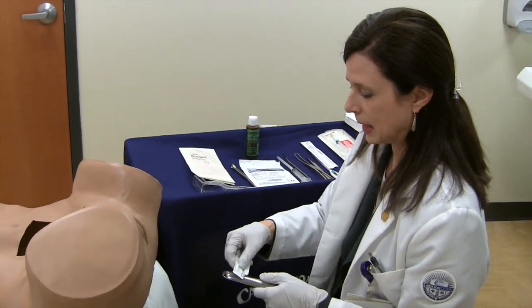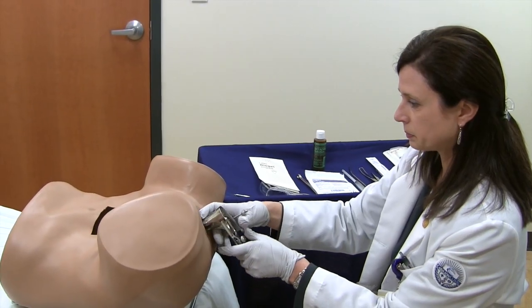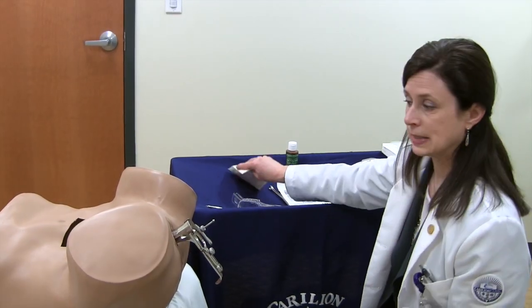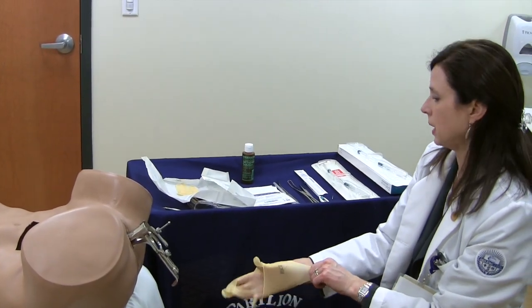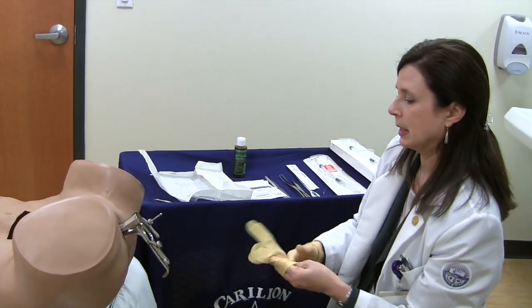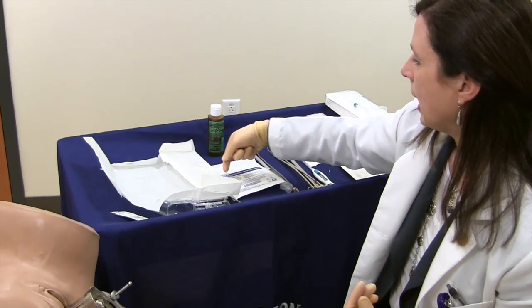We have both metal as well as plastic speculums available. Using a little water-based KY jelly to decrease the trauma on the actual ZOE tissue. Feedback can be given with regard to speculum insertion techniques. Once the cervix is fully visualized, next give a little bit of feedback to the learner about sterile exam and use of sterile gloves. Everything is set up on the table in the order in which the provider will be going through the steps, and it's helpful to have various glove sizes available. The next step is to utilize either a betadine solution, a Hibiclens, and the 4x4, as well as the ring forceps. You would not want to use iodine with the ZOE model.